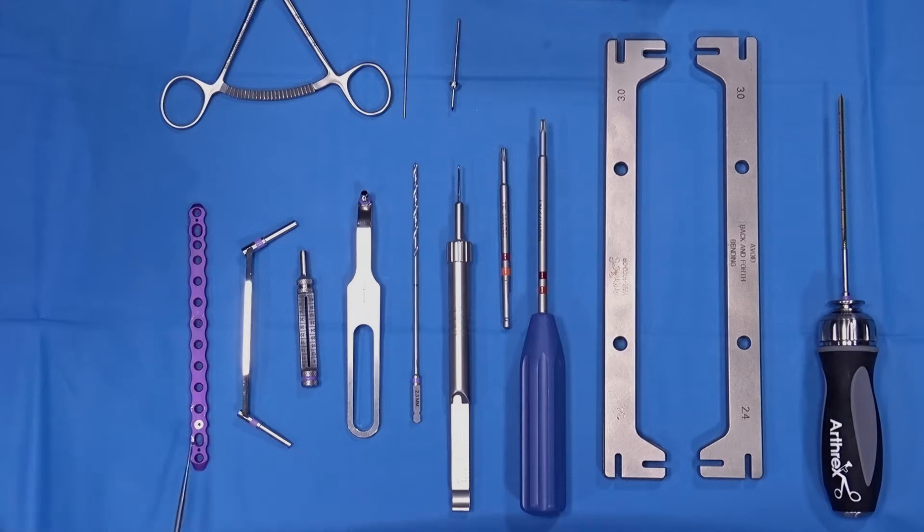There are two separate holes for K-wires for temporary fixation of the plate to the bone. The second device is a standard drill sleeve for a 2.3 millimeter drill bit that will be used for both the cortical screws, locking screws, as well as variable angle locking screws.